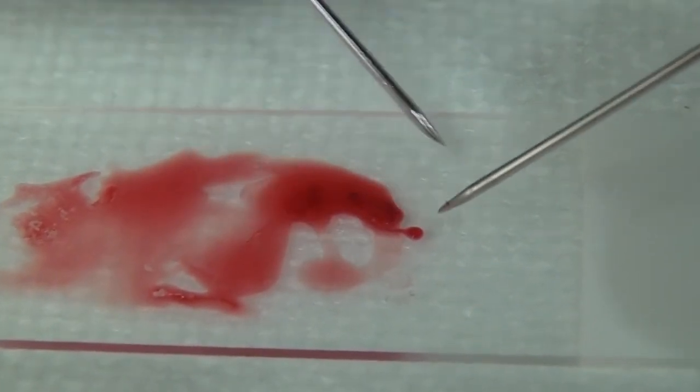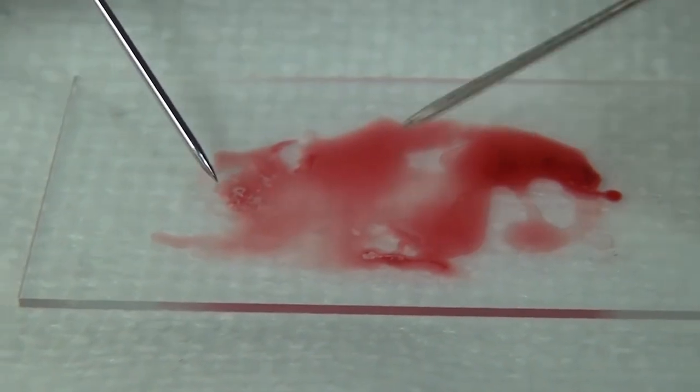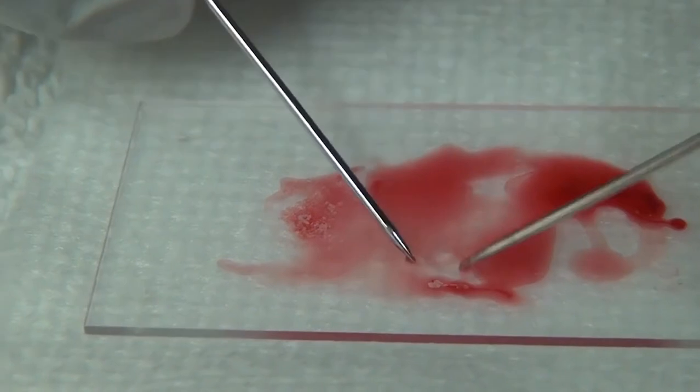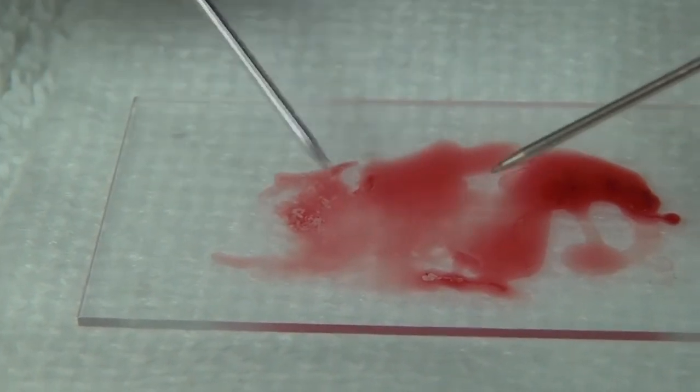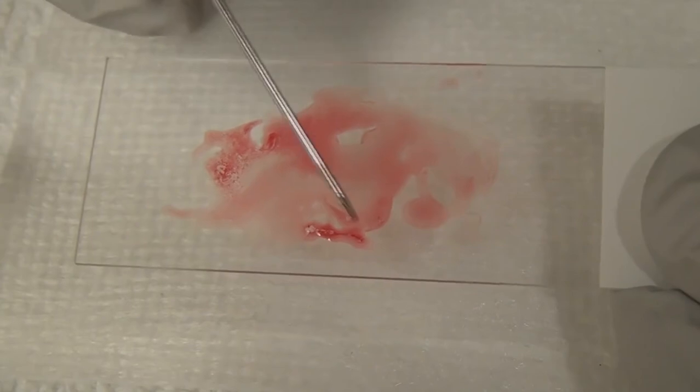So I'm going to put this into formalin. Over here there's some microcore without much height. You can't pick this up, but it's going to make an amazingly good cytology, both from here and from here. Taking that blood plus core, I place it into the formalin over here. Okay, now let's look back right in here. And again, this is all pure microcore in here.